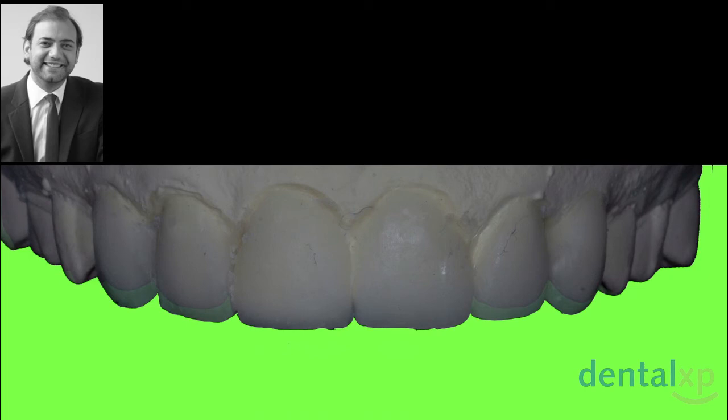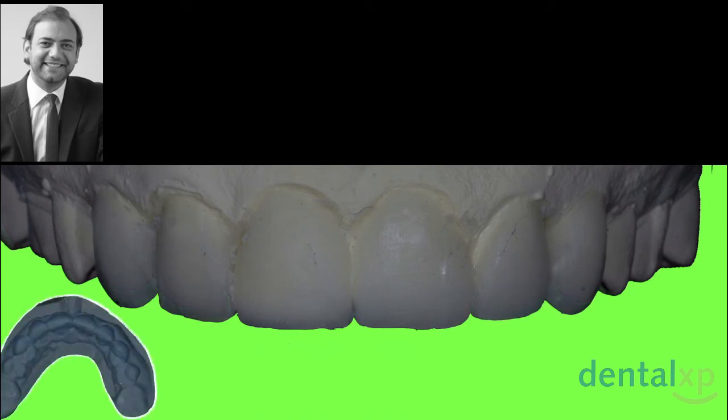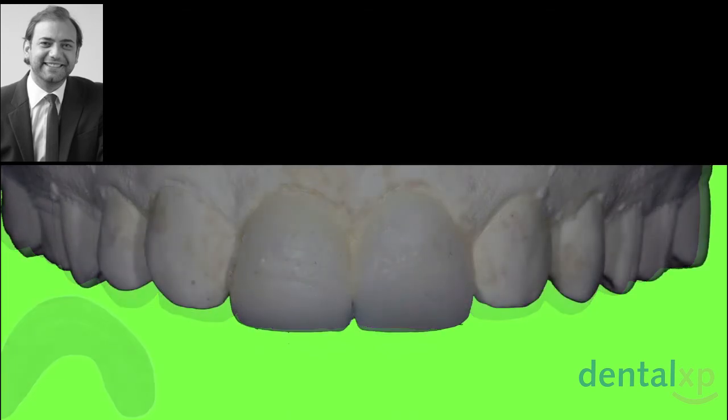We do the mock-up, described by another great friend, Galip Gurel, and we let the patient choose. Now, I know that we are going to do surgery, but this is how we gain trust from our patient, and it's easier for them to understand that surgery is not the whole thing, and prosthetics are as equal, if not more important.